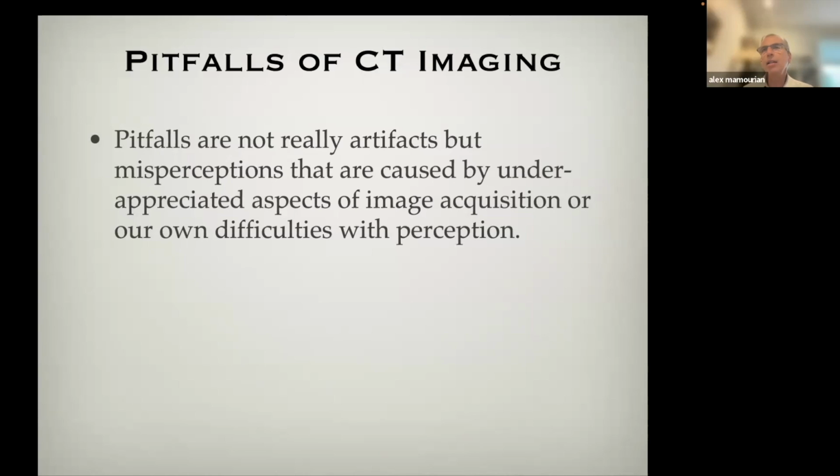I generally divide these notions of artifacts and pitfalls. I use those terms in different ways. I think a pitfall is something that's inherent in the technique that is helpful to be aware of. I used to have a boss when I worked in a fire equipment company, and he used to say, when you see a hole and you fall in, that's not bad luck. That's just dumb. So we want to avoid falling into the holes if we know where they are.